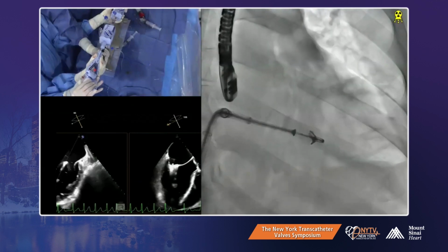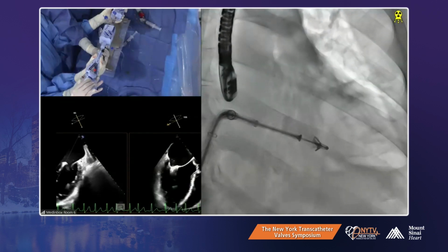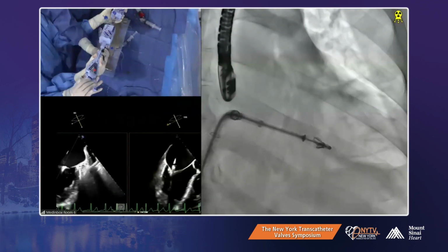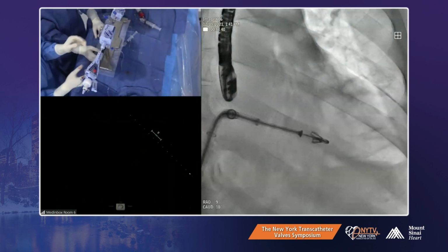Look at the posterior, please. Push and hold. Thank you. Usually, we always check orientation to close the clip. I usually check orientation before grasping and after grasping, because if you distort a valve with an XT, it's frozen. We're closing.